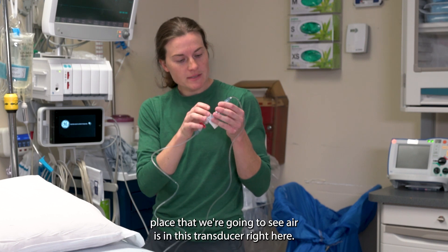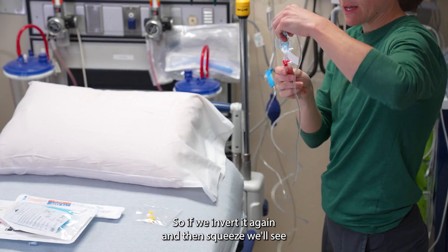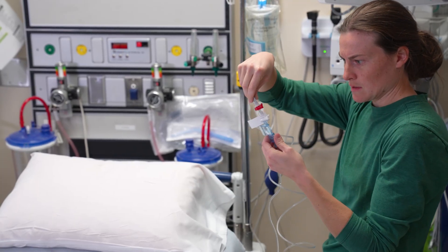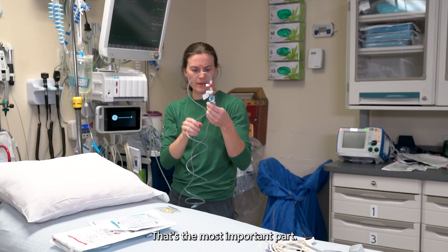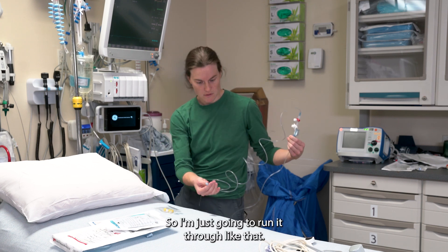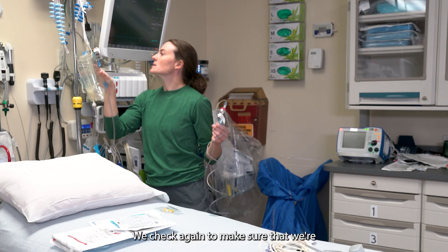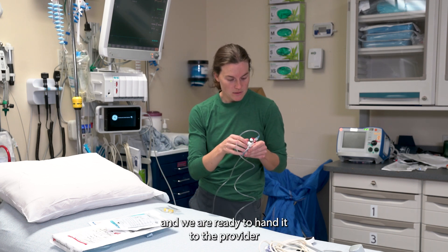The most common place that we're going to see air is in this transducer right here. If we invert it again and then squeeze, we'll see that all of the air will come out. Play around with it until you see that there is no air — that's the most important part. In this tubing I find a little bit of air still, so I'm just going to run it through like that. Now we have a fully pressurized line. We check again to make sure that we're at 300 millimeters of mercury, which we are, and we are ready to hand it to the provider.